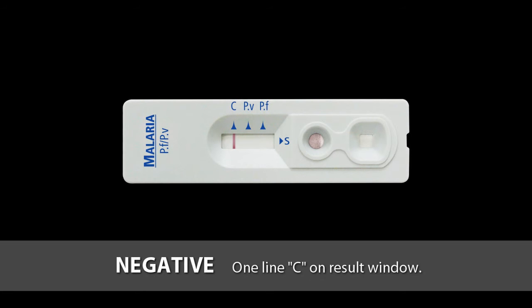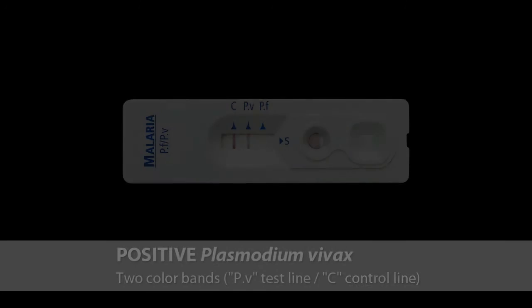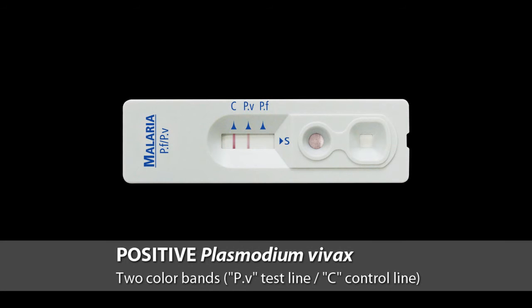Only one line C on the result window means negative. Two color bands on PF and C line mean Plasmodium falciparum positive. Two color bands on PV and C line mean Plasmodium vivax positive.